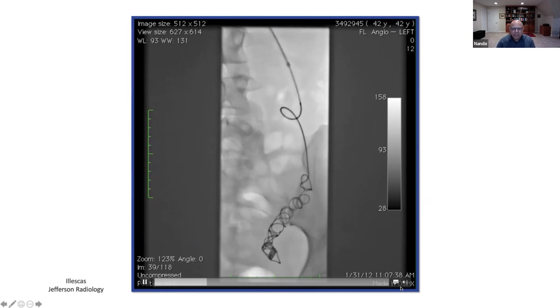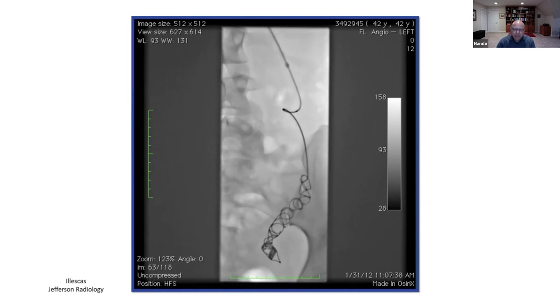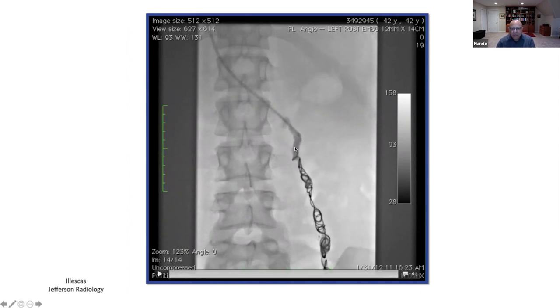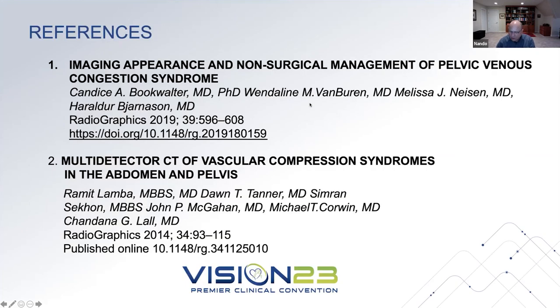This is further embolization, and you can see as we straighten out the gonadal vein and the wires push the coils, we eventually pack the gonadal vein. A puff of contrast via the sheath shows lack of reflux down the gonadal vein, and the coils are stable away from the level of the renal vein. Subsequent cases we'll use will be from these two references that show exquisite anatomy.